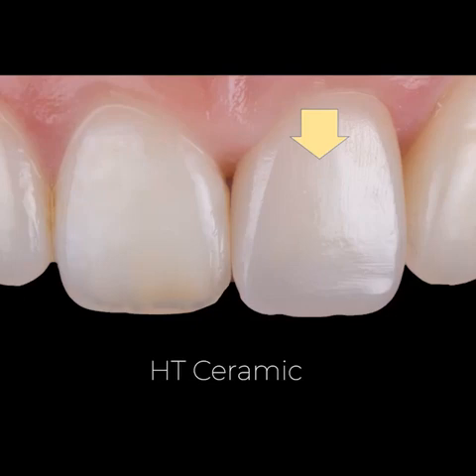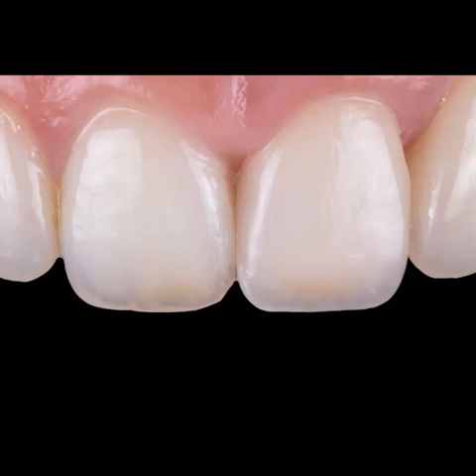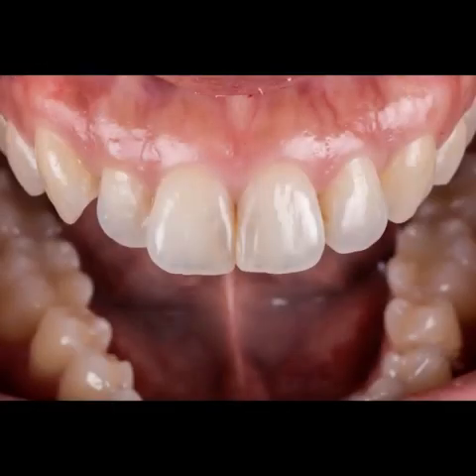And if your restoration is too dark because of its intrinsic translucency, there's very little that you can do to salvage this. Remember that for one-visit chairside restorations, we don't have the luxury of cutback and layering. And so usually the best thing to do is to choose another ceramic with lower translucency and then apply extrinsic changes. Does that mean ceramics with higher translucencies are not as useful?